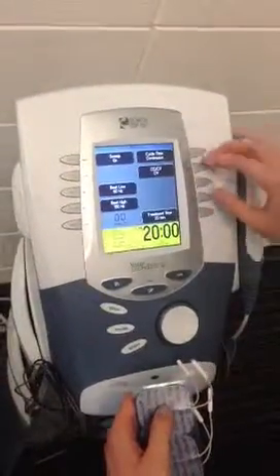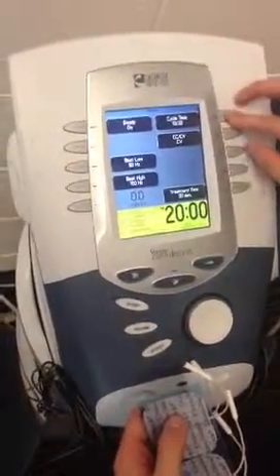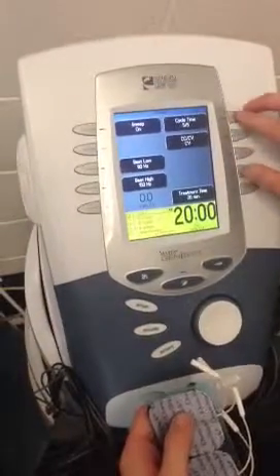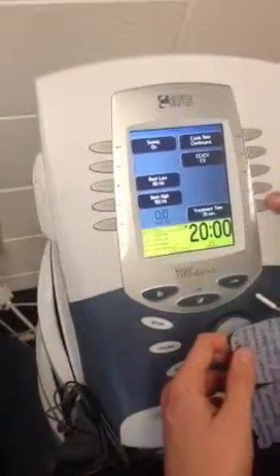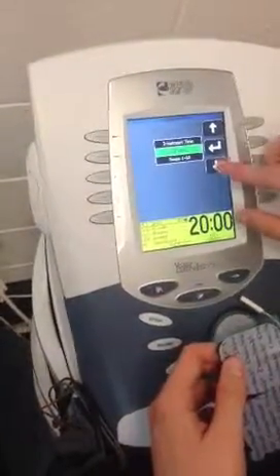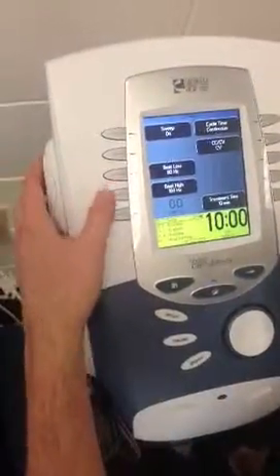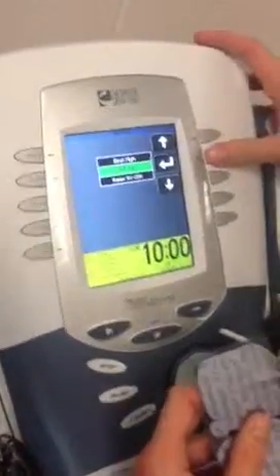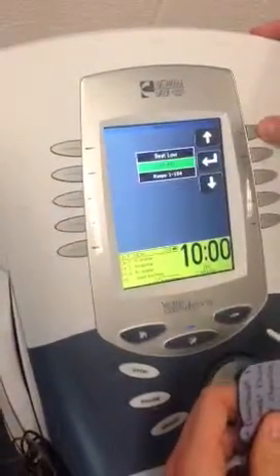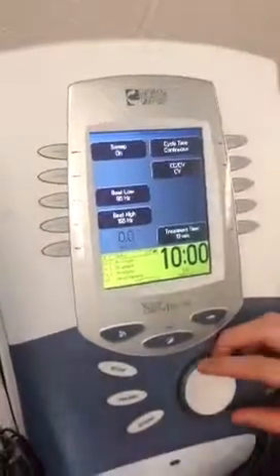We're going to edit the time. For this sake, I can show you that you can edit the treatment time, but what we're going to do is just set it on continuous. Okay, continuous. The treatment time, we'll say 10 minutes. The frequency high we'll put at 155, and the low we'll put at 85. Okay, so now because we're doing premod, I only need 2 pads.